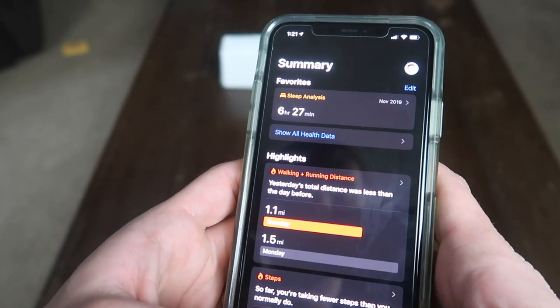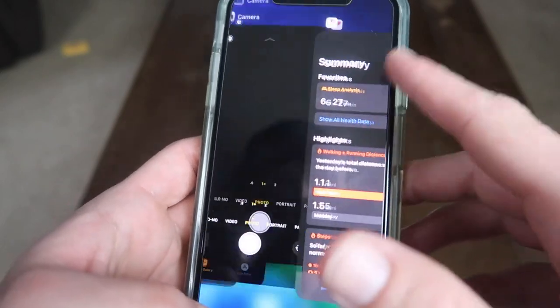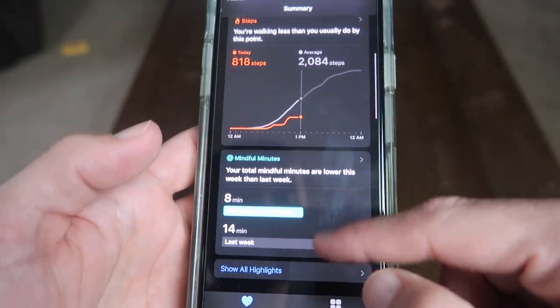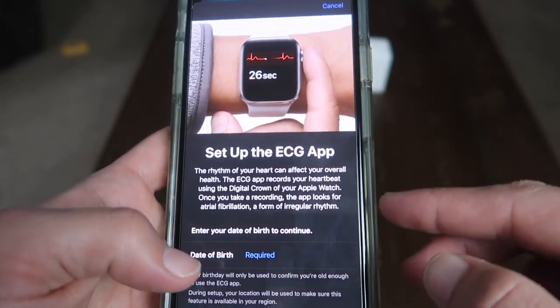I am here to do a video on the EKG feature of the Apple Watch Series 5. I have that on my wrist right now. You have to go into your health app first. So if you open up the health app, you can go down here to set up ECG app, not EKG app.